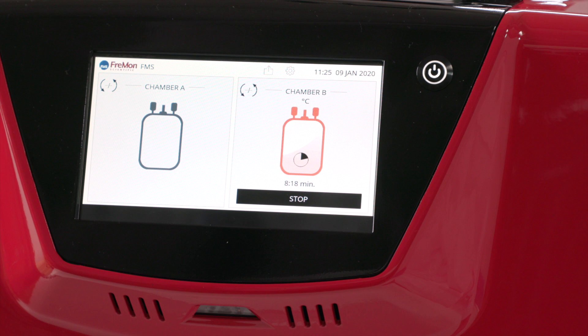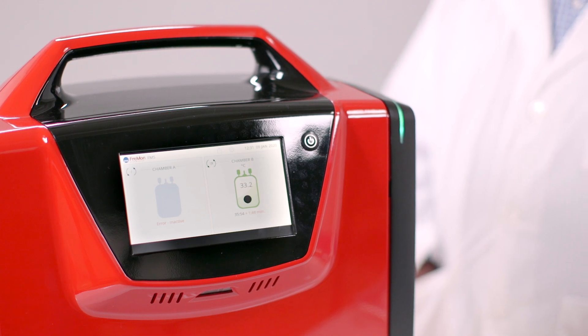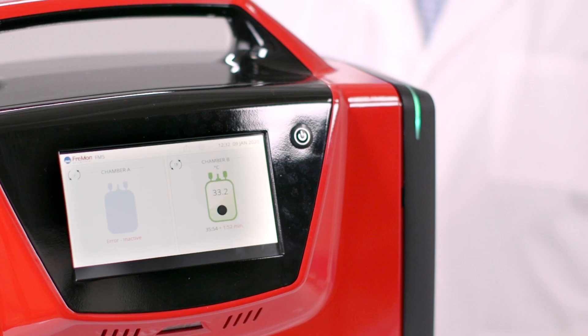For now we'll focus on chamber B's thawing cycle. Please note the chamber light is still orange and so is the icon on the screen for chamber B. We're almost done with the thaw — here's the temperature at nearly 33 degrees and here's the elapsed time.